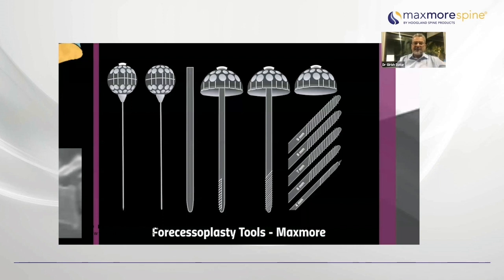The new kind of drills that we developed are conical drills like this, which cut only in 30% of the entire circumference. Because of this, you can direct the smooth part of the drill towards the spinal canal and use not complete rotatory movements, but jogging movements in a 90 degree arc, so that you are able to take off the overhanging part of the superior articular process, which is the lamina part of SAP, the medial wall of the pedicle, and caudally the part of the vertebral body.